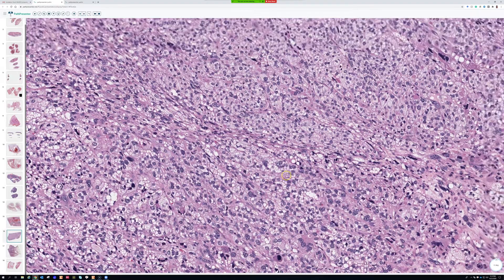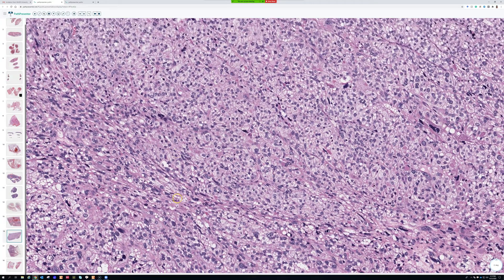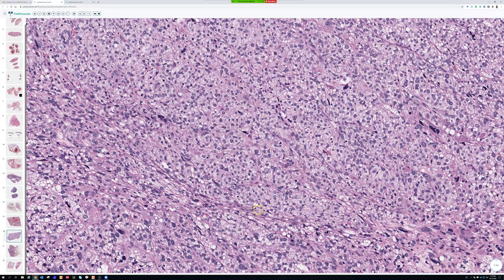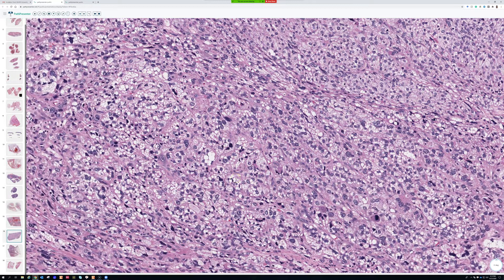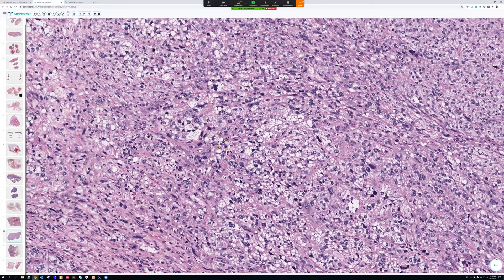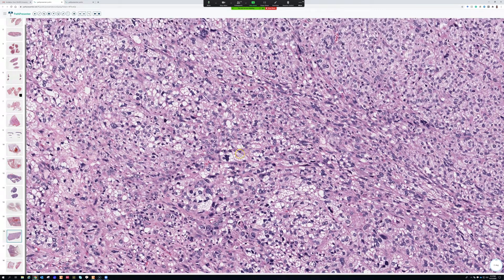There is some morphologic similarity to adrenocortical carcinoma. In cases that don't have as much bubbly, foamy cytoplasm, they can just be sheets of epithelioid cells with only scattered lipoblasts, and those could be confused with a wide variety of other epithelioid tumors — either soft tissue epithelioid tumors or even carcinomas. That's an important thing to keep in mind.